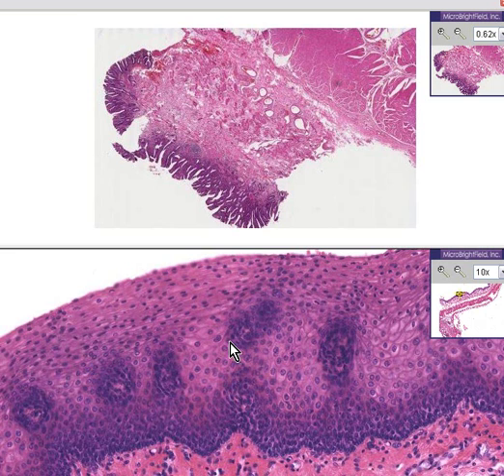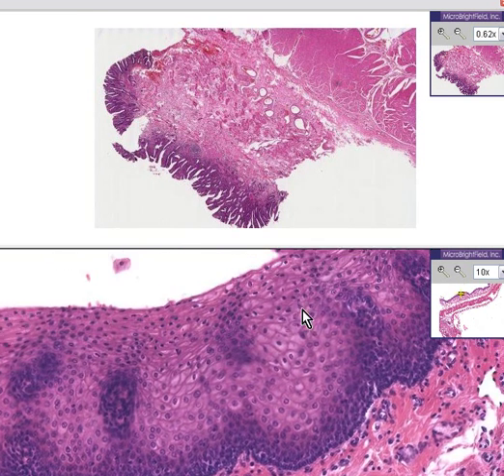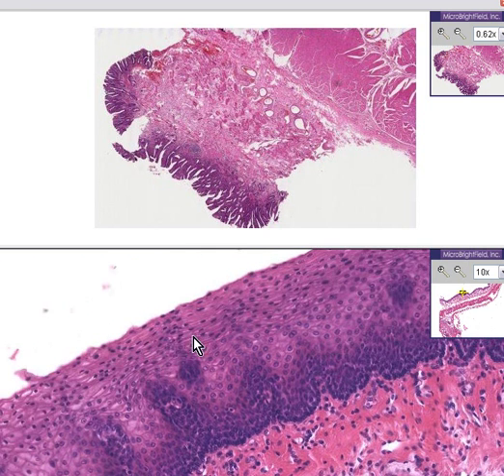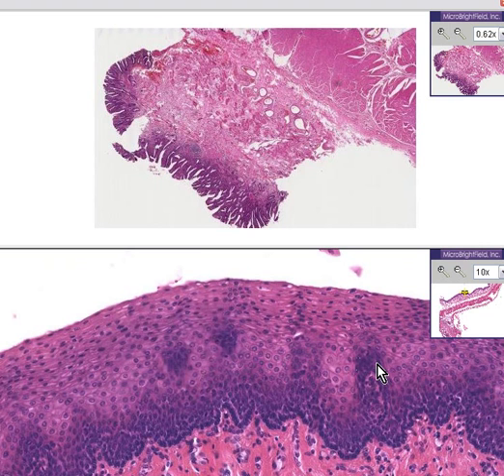Notice there are no hair follicles or sweat glands, and please notice that there's no keratinization either. The nuclei extend all the way to the surface. This is what a normal esophagus mucosa should look like 100%.